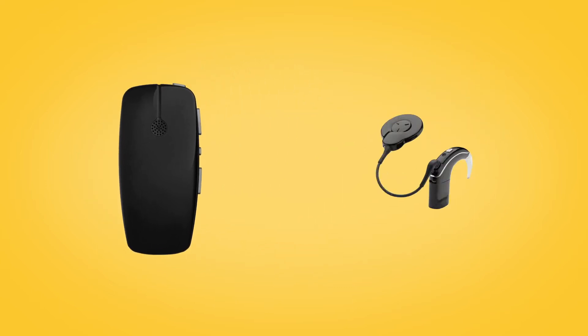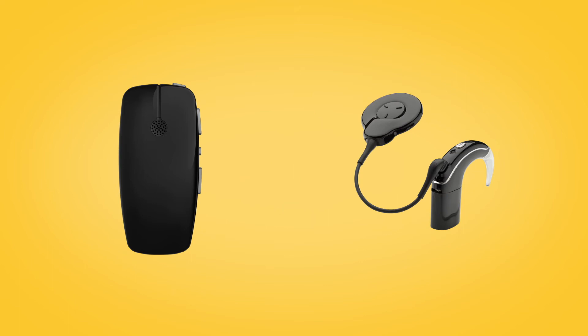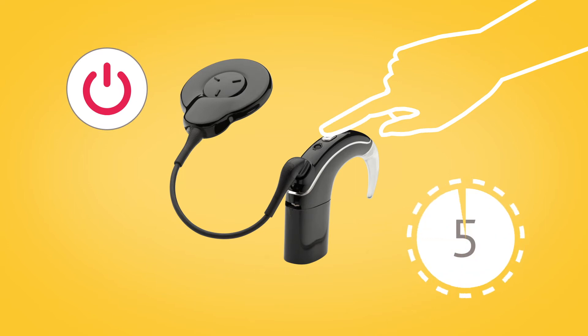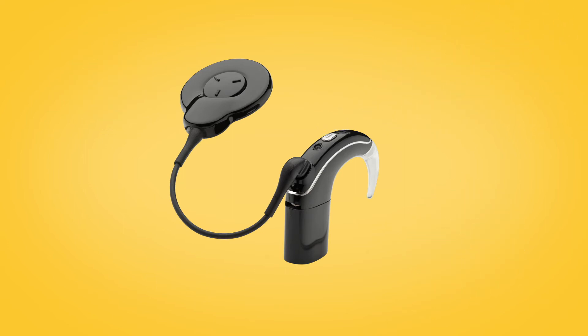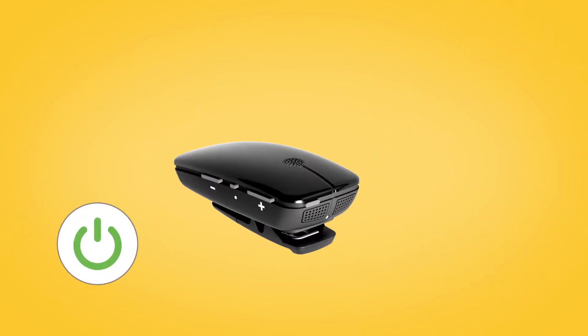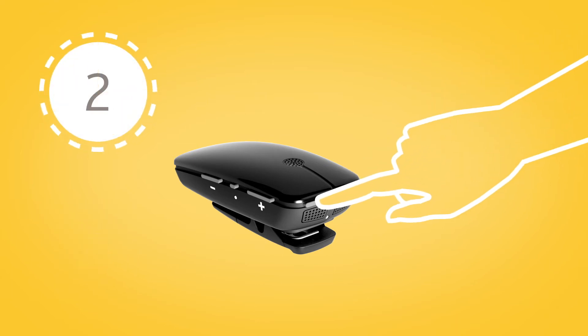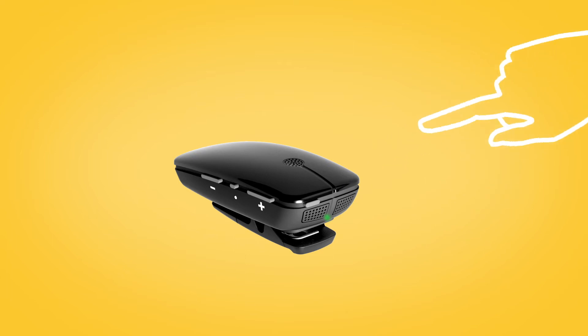To pair your mini microphone with your Nucleus 7 sound processor, remove and turn off your sound processor. Then power on your mini microphone by pressing and holding the on-off button for two seconds until the LED turns green.